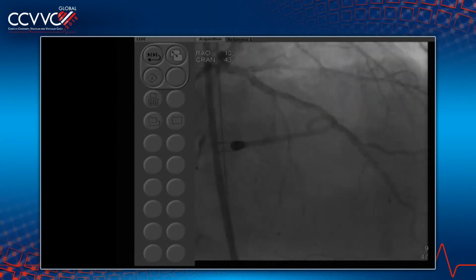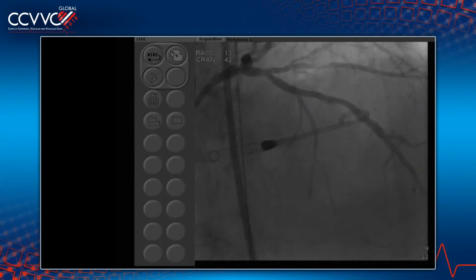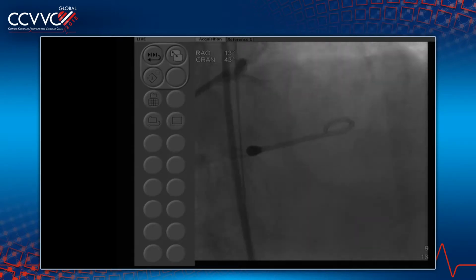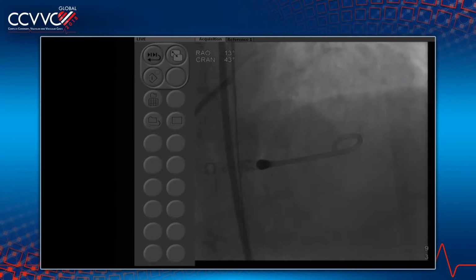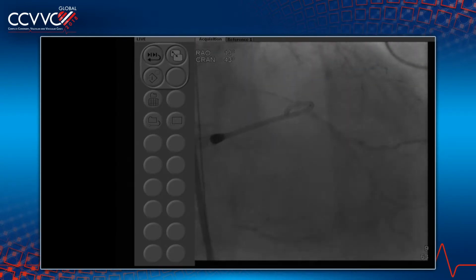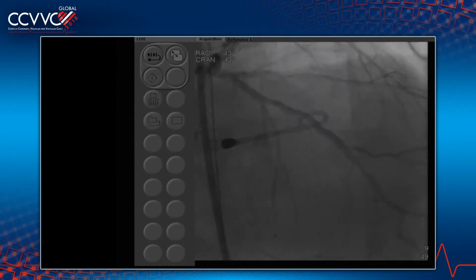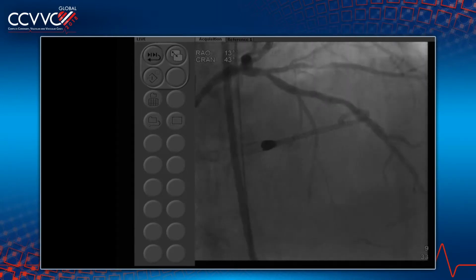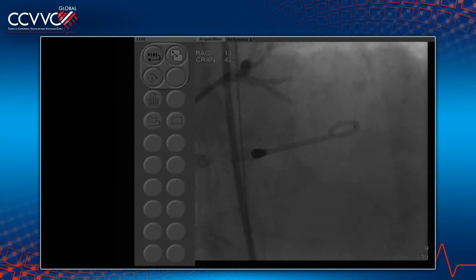Yeah, so we have a couple of comments before you move forward. I think evaluation of the left main, many probably on this panel. I mean, physiology, Dr. Sharma, you gave a beautiful lecture, by the way. I want those slides. Excellent lecture this morning. Your top number one advance this last year is the use of physiology in our armamentarium. But I think the left main is different. Chet, you had a comment, and Antonio Colombo.